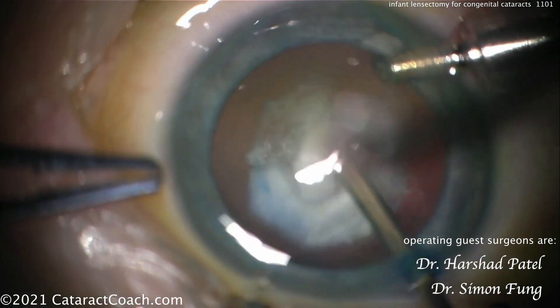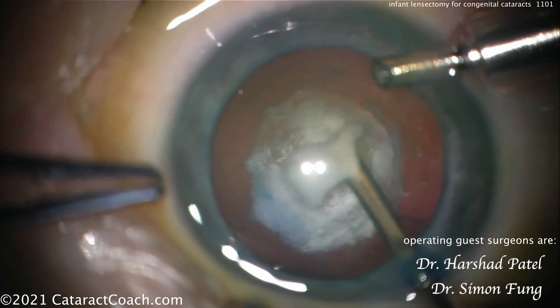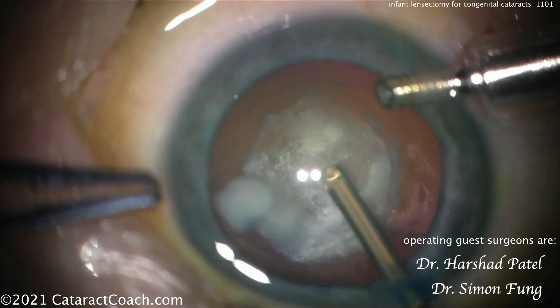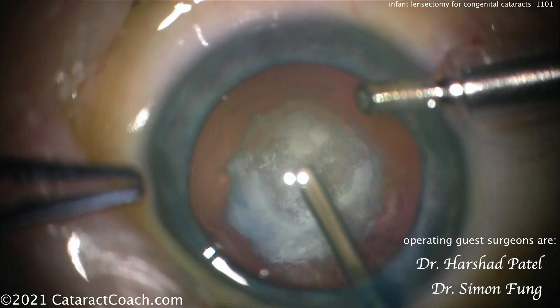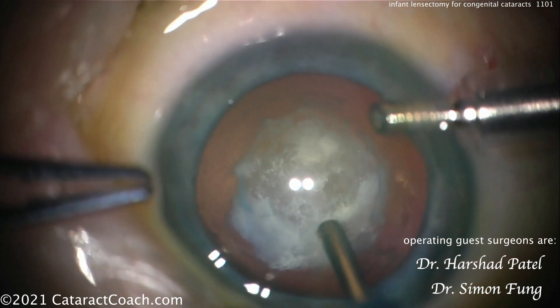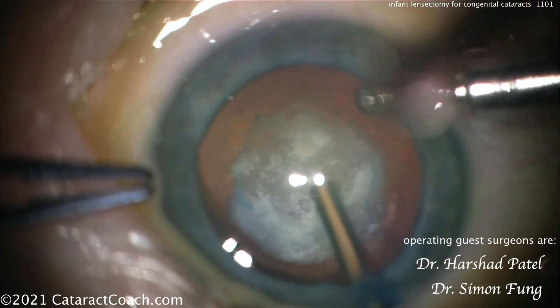A trick I recommend: you still use the same instrument — that anterior vitrector — but on your phaco machine, hit the IA mode for cortex removal. Then your foot pedal now only has two positions: position one for irrigation, two for aspiration. That will allow you to go out there in the periphery without the fear of inadvertently pushing your pedal down too far and going to position three and making some cuts. You don't want to do that.